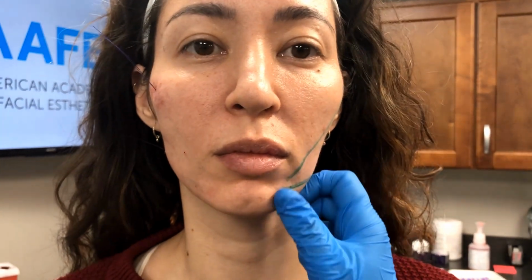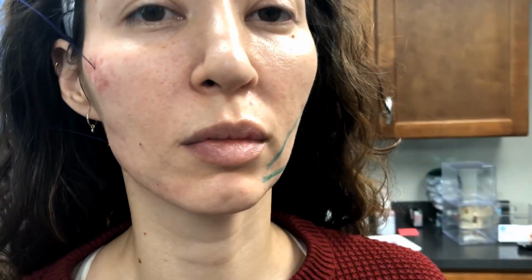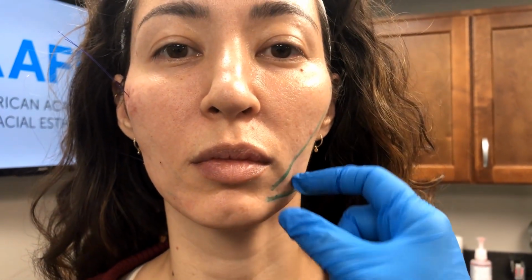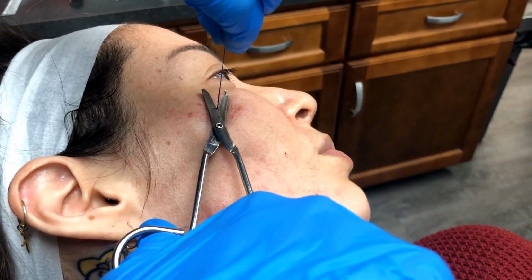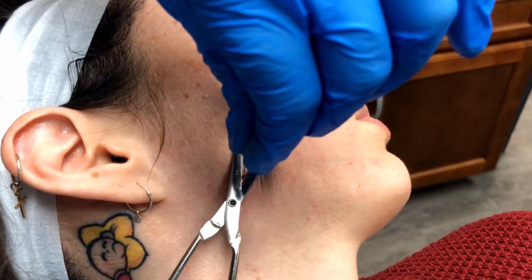Now, let's take a look side by side. Look at the area, her left side, that is hanging down, and look at that beautiful jawline lift and that 2-vector lift as it pulls up and pulls back. That is an incredible side by side that you just saw happen right in front of your eyes, and it's really amazing. We get excited. We love these cases. We get super excited because it's an immediate visible result that gets better over time.